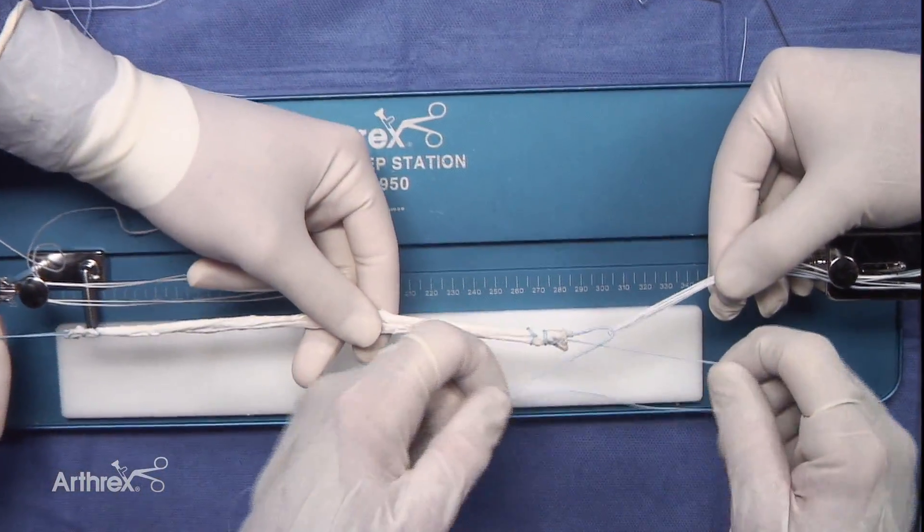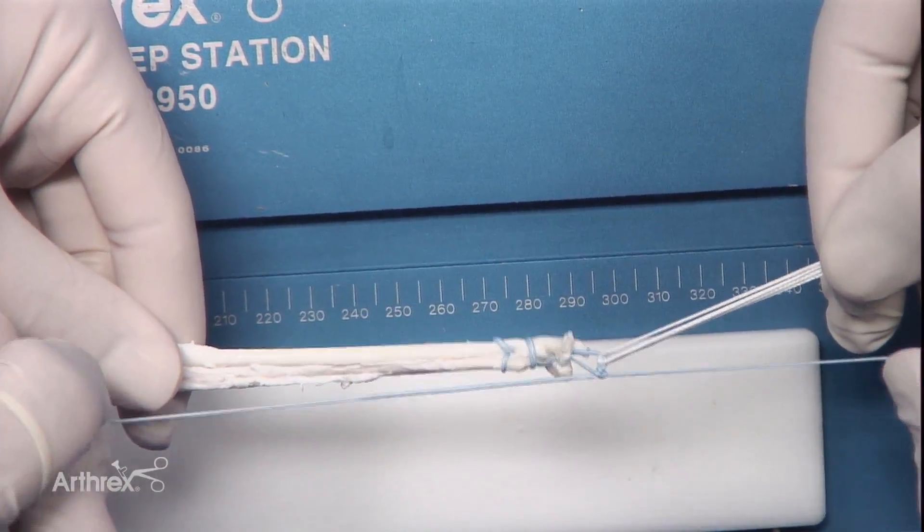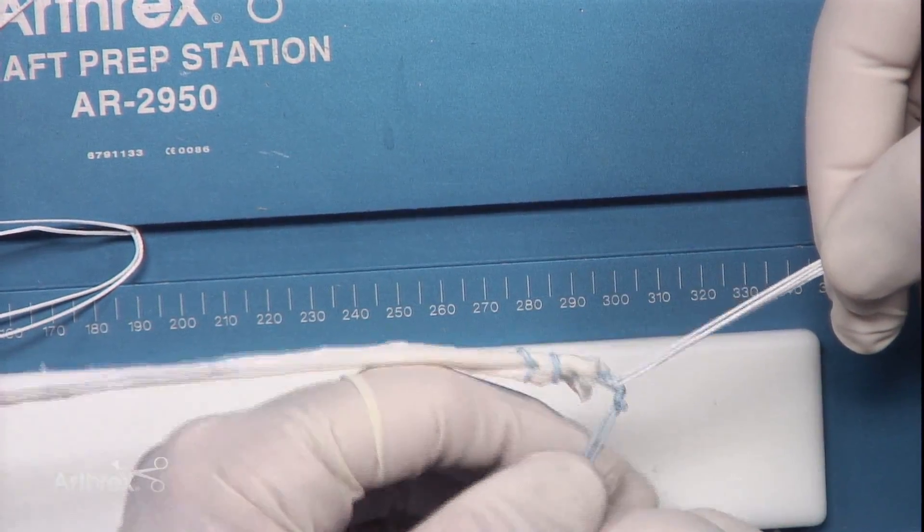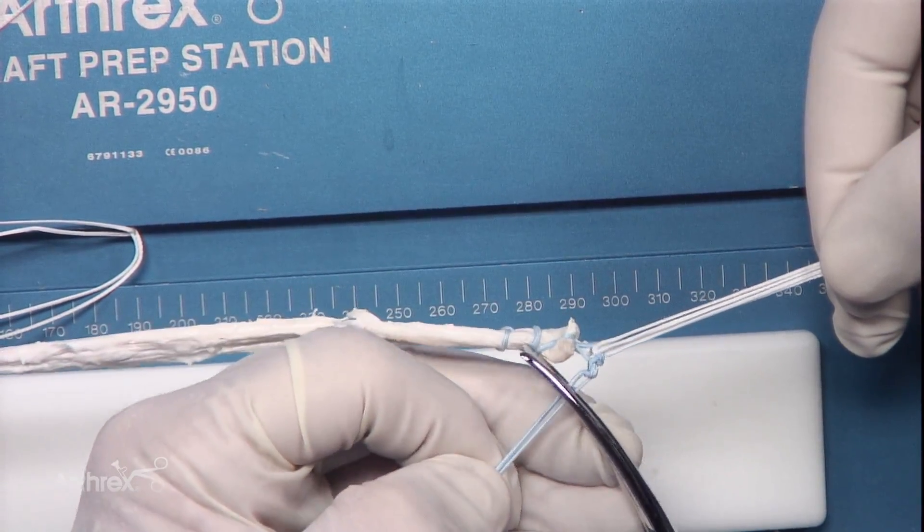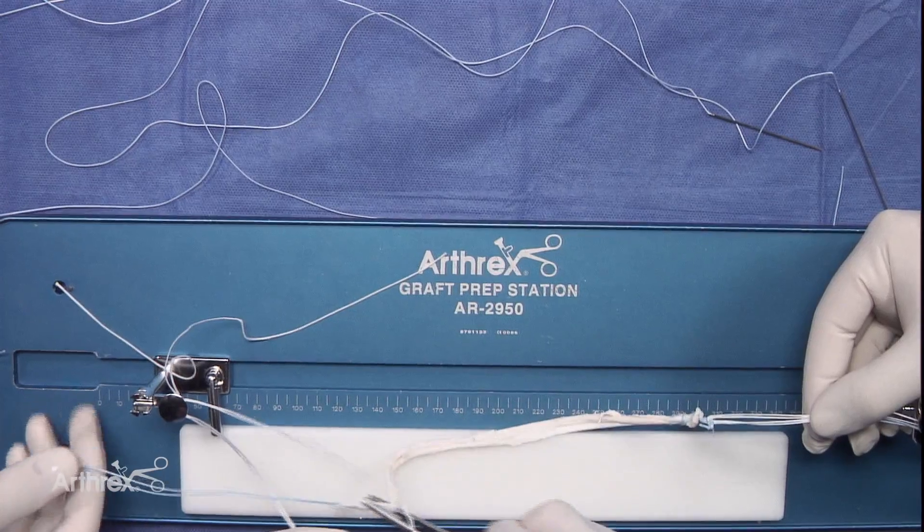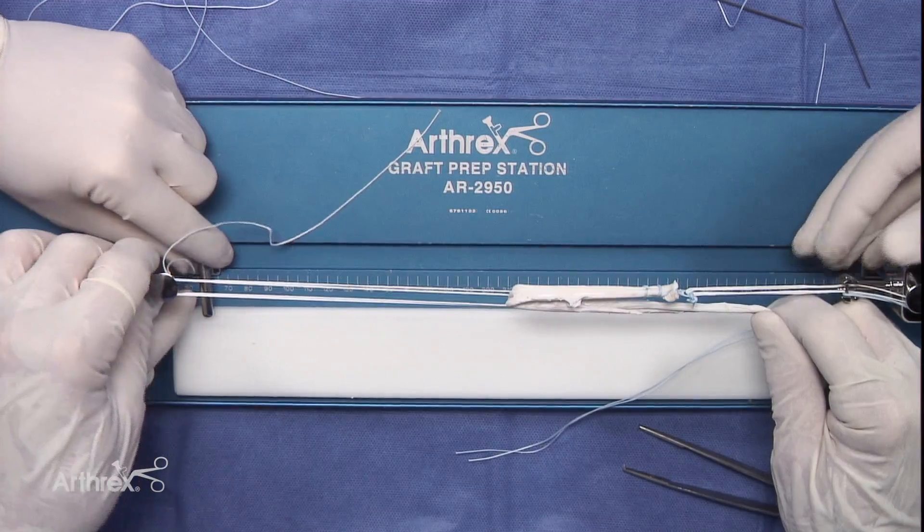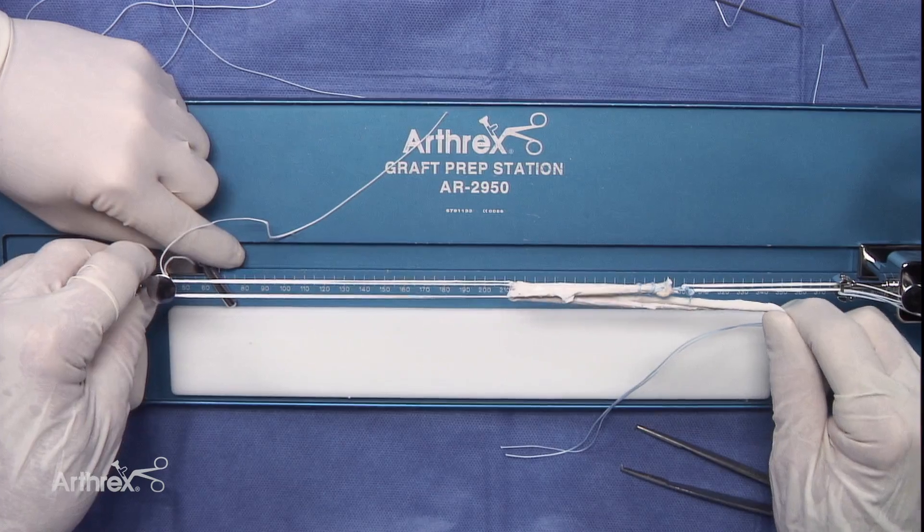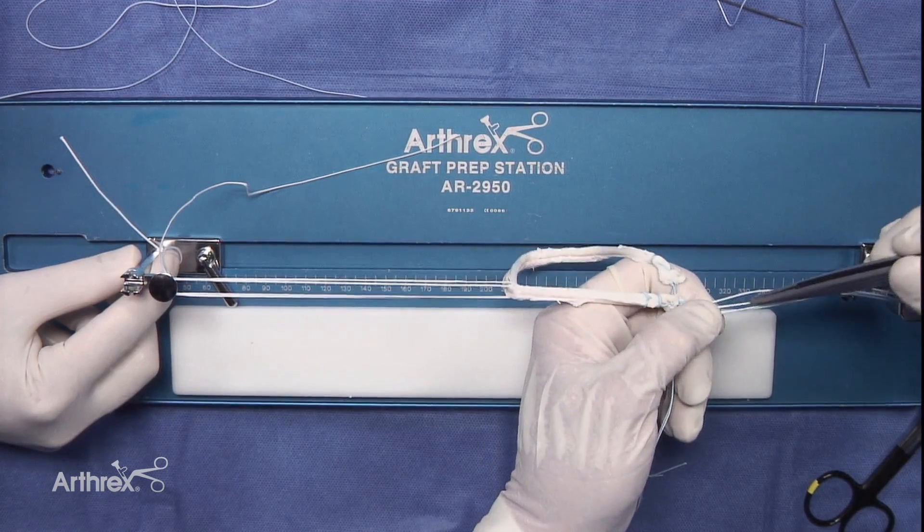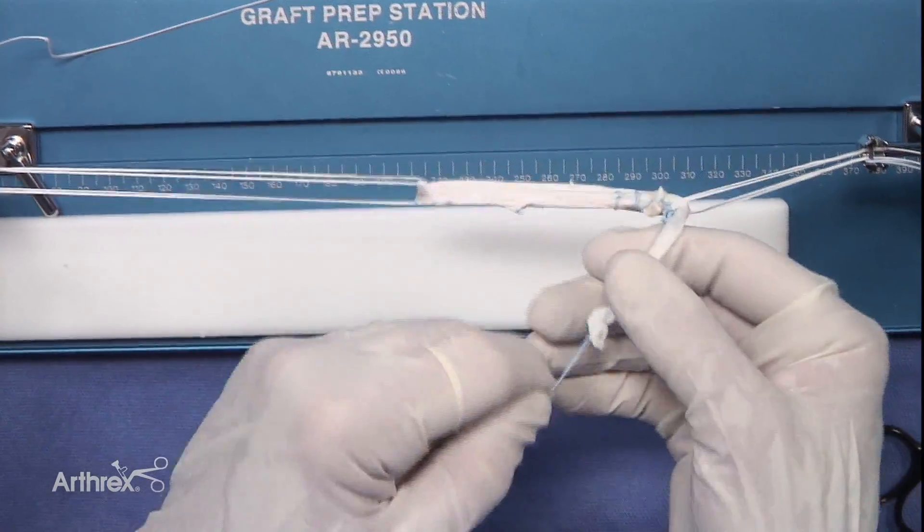We'll cut that portion. We're going to take the graft and pass that through. We're going to relax the graft station. This graft is going to be approximately 70 millimeters.